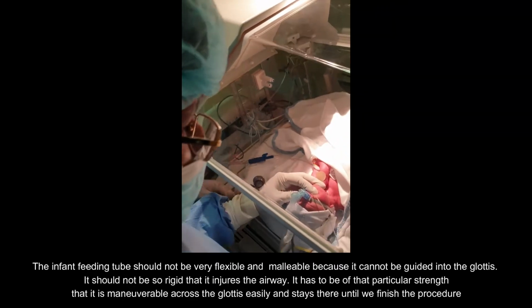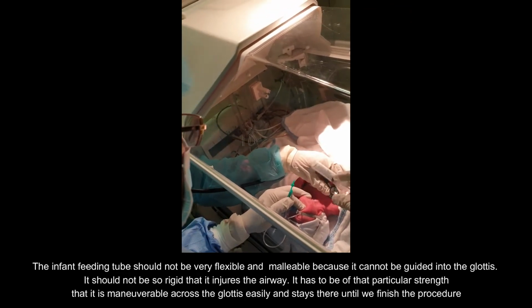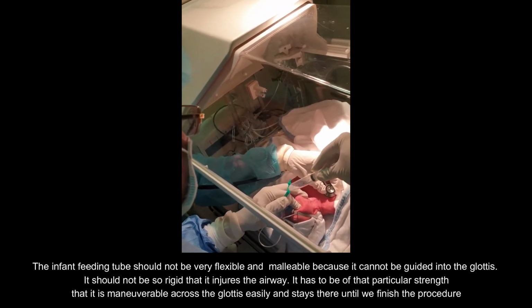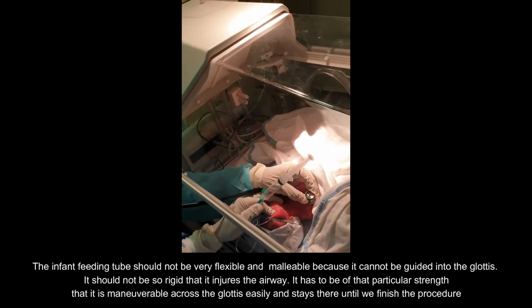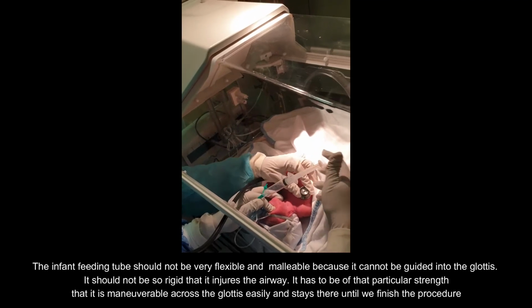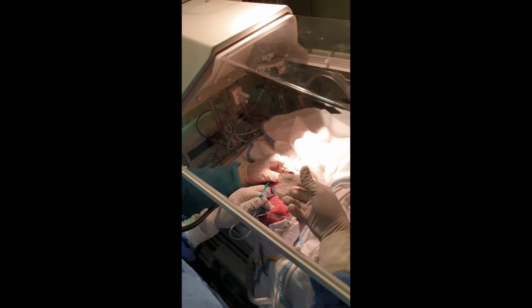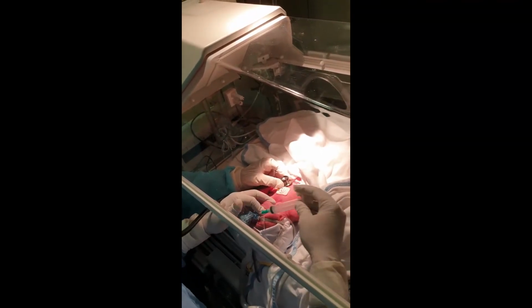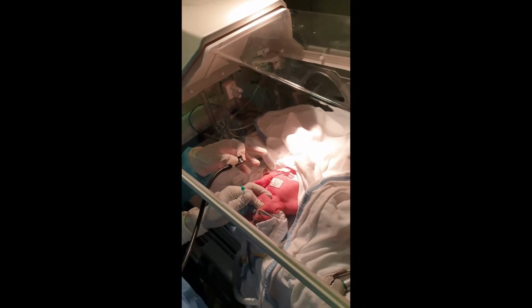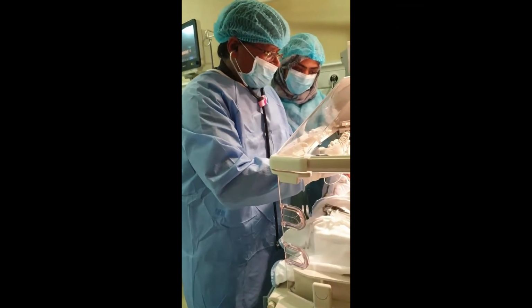The infant feeding tube material is very important. It should not be very flexible and malleable, because then it cannot be guided into the glottis. It cannot be so rigid that it injures the airway. It has to be of particular strength that it is maneuverable across the glottis easily and stays there until we finish the procedure. From my practical experience, I find this particular brand, Microtech infant feeding tube, fits and is very useful for doing less invasive surfactant administration. That is missed by using the thin infant feeding tube.